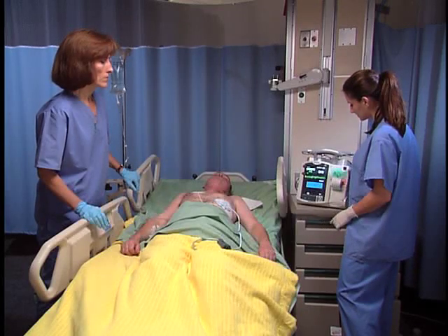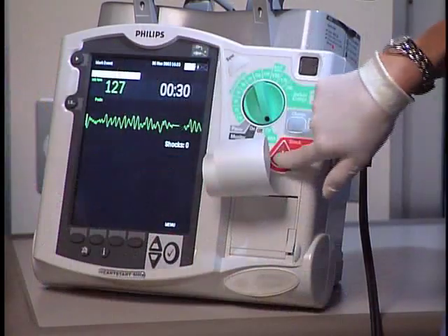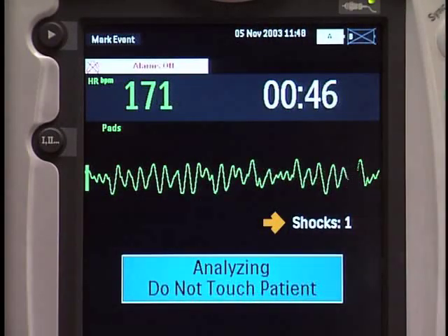Make sure no one is touching the patient or anything connected to the patient. Upon delivery of the shock, the shock counter registers the number of shocks delivered.